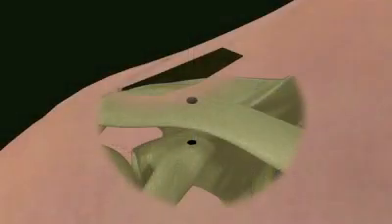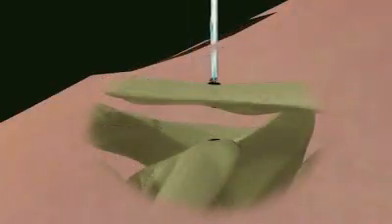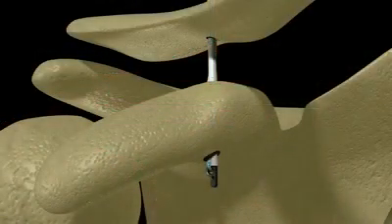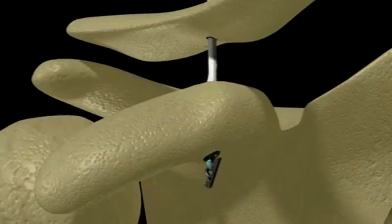Insert the toggle lock implant from the top by using the toggle lock pusher. Push the implant down through the clavicle and coracoid. Deploy the toggle lock implant on the undersurface of the coracoid.